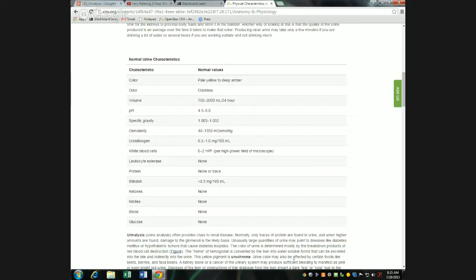In a relaxed bladder, the transitional cells are usually big, kind of pillowy round cells, and then they can be stretched out and they become thinner. We wouldn't call them squamous. They're still transitional cells. They've just been stretched out a little bit. It allows for the bladder to stretch out and accommodate more volume.